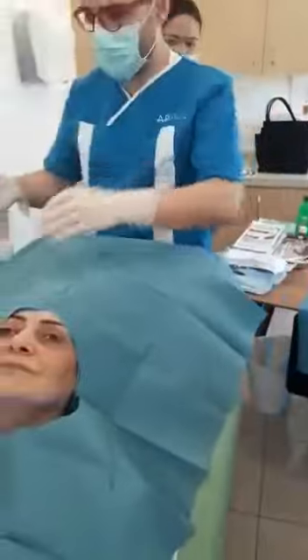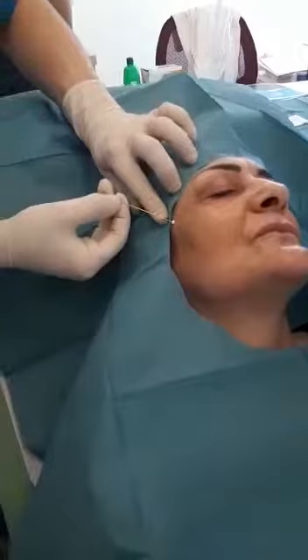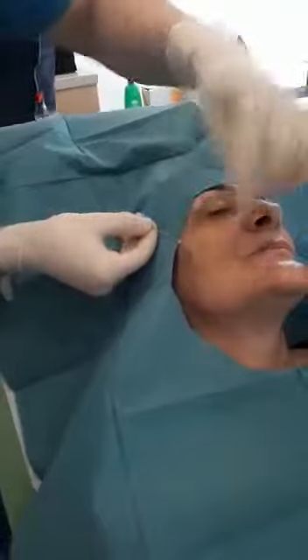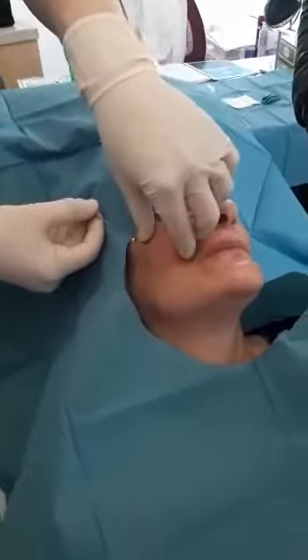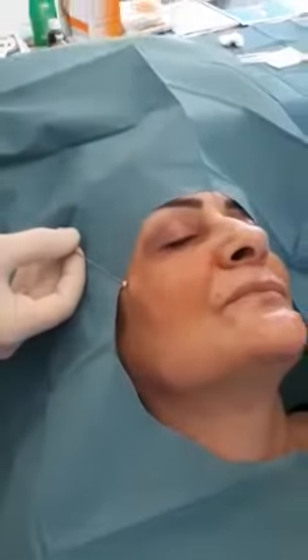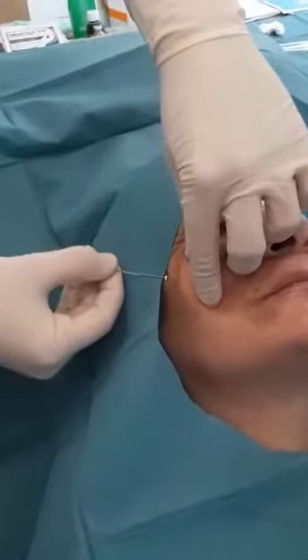Okay? Look at this. Now, a bit, yes. You enter. You just engage your thread in the tissue, and then you do like this. You do not have to pinch, okay? Because if you pinch, all the layers will come after you, and so the mass and the deep layer will come up. Rotate it on the plane you are. Just rotate it, and go to fix.